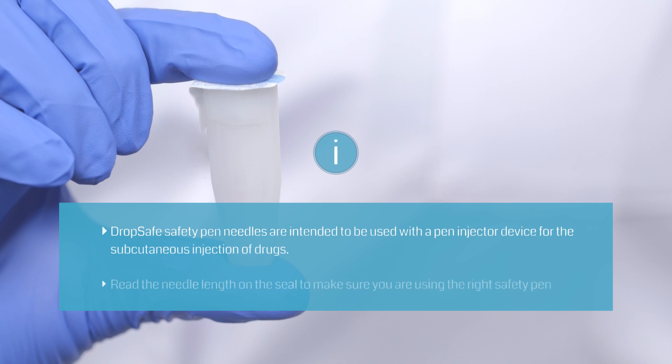DropSafe safety pen needles fit all major brands of pen injectors. Read the needle length on the seal to make sure you are using the right safety pen needle.